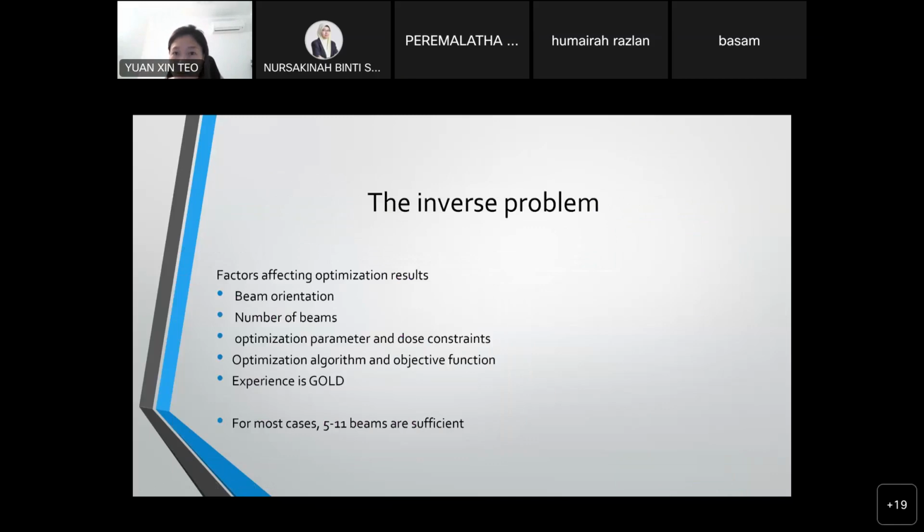If there is no question, then I will continue, because actually today our section on IMRT is very complicated and very difficult to imagine. Based on the textbook, it's very difficult to understand all this. IMRT depends very much on the treatment planning system and treatment planning skills, but we still need to understand the basics and the requirements.